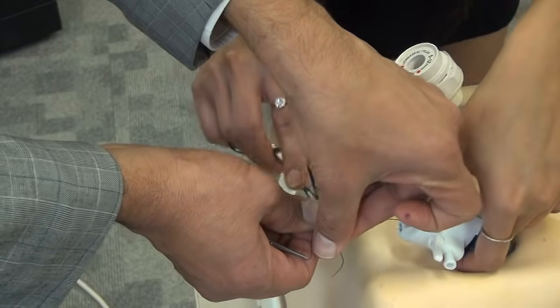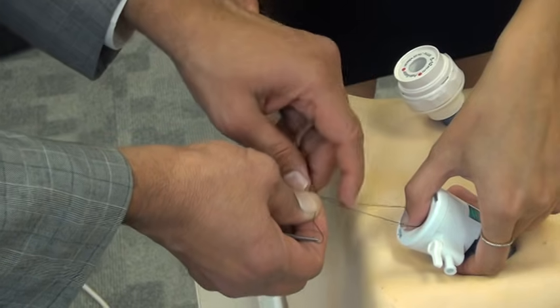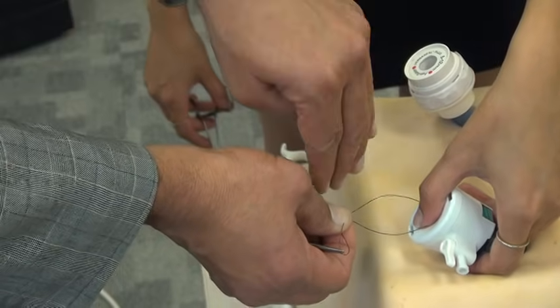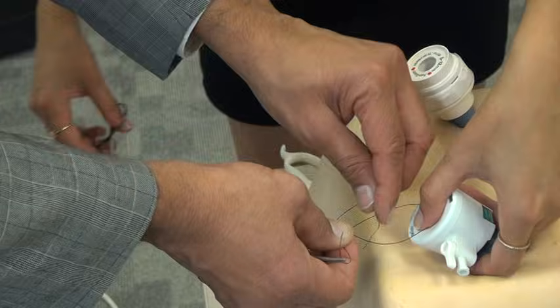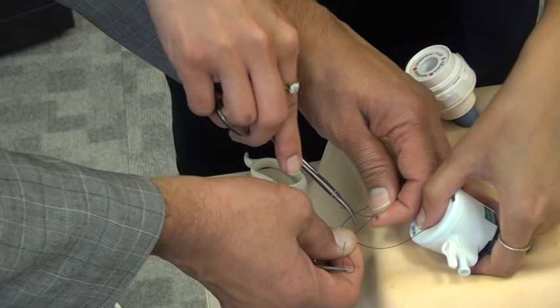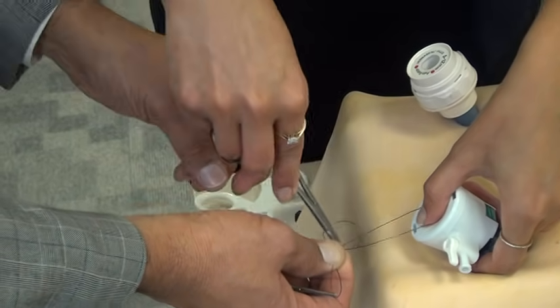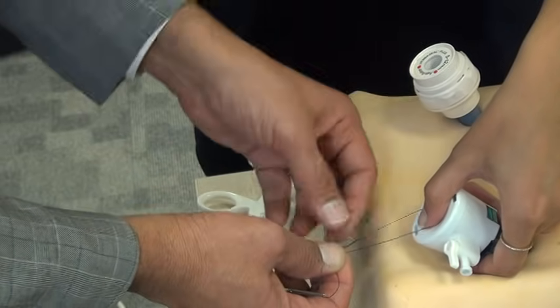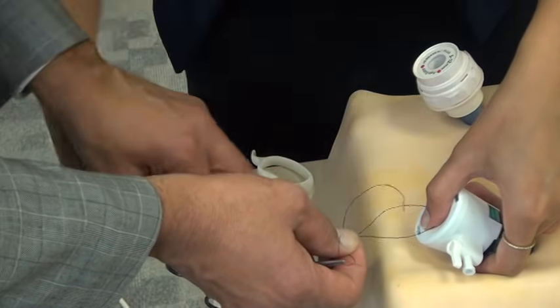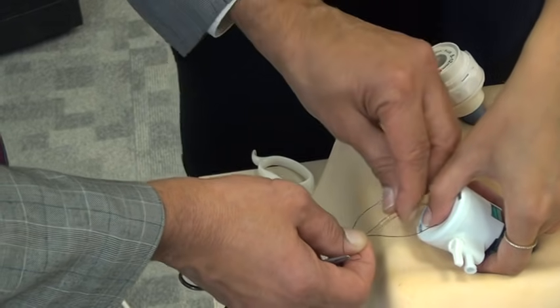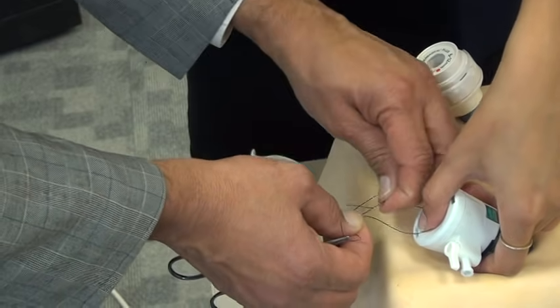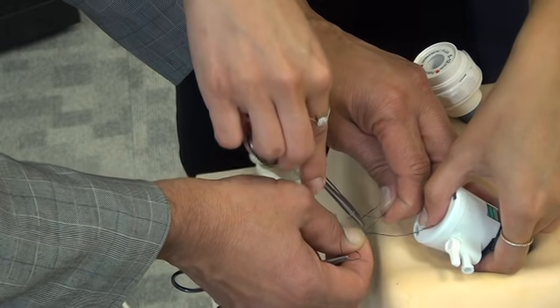Second throw, and now the third is sort of half throw. So this time your assistant will come from the top to pick it up from here. From the top. It's coming here and you just sort of here. Now this half throw, the assistant comes from the top and picks it up.